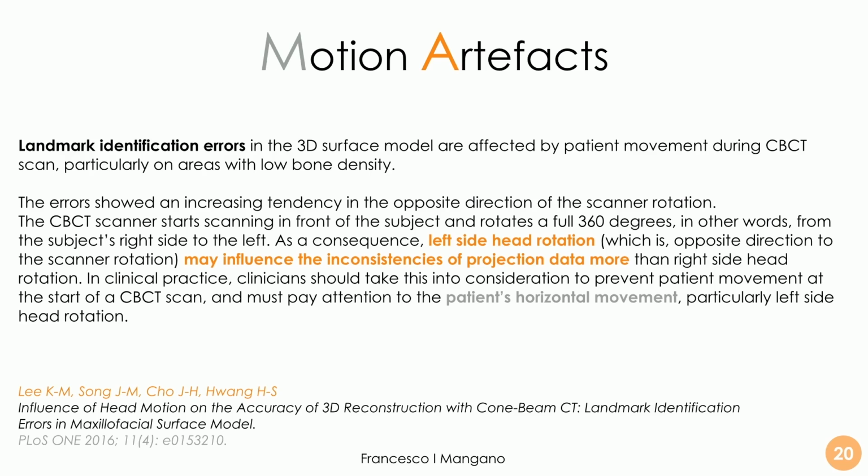This article is also very interesting because they say that there's a particular problem considering the way cone beam computed tomography usually works, particularly when there is a horizontal rotation of the head, and particularly left side rotation, which is usually the opposite direction to the scanner rotation, because this left side head rotation may influence the inconsistencies of projection data more than the right side head rotation.